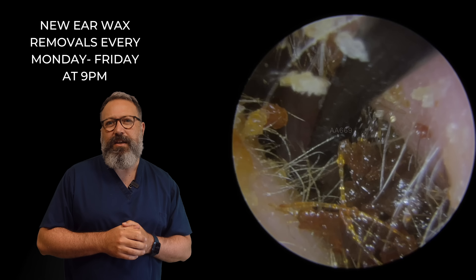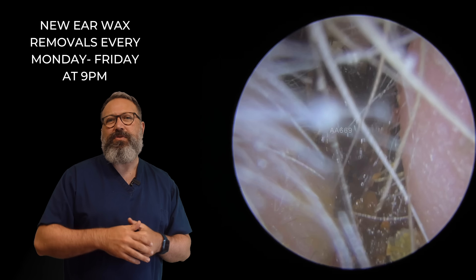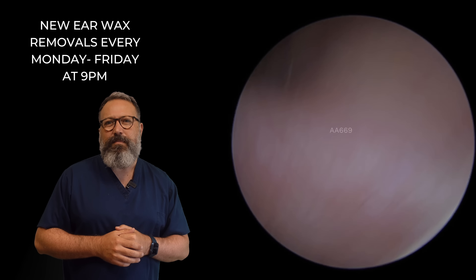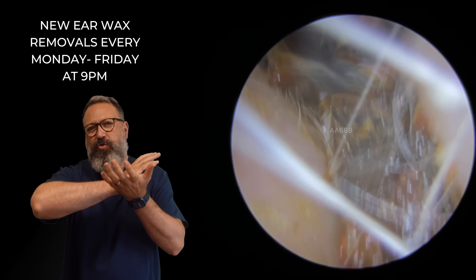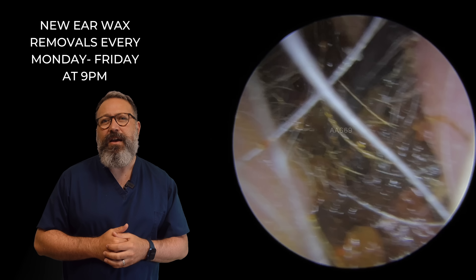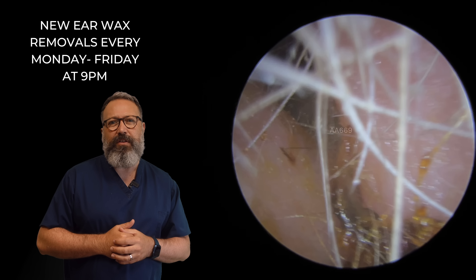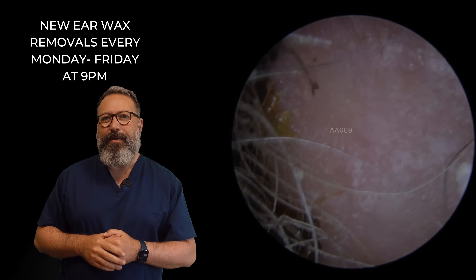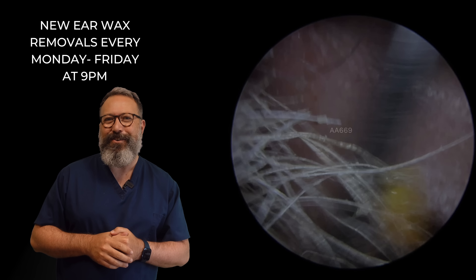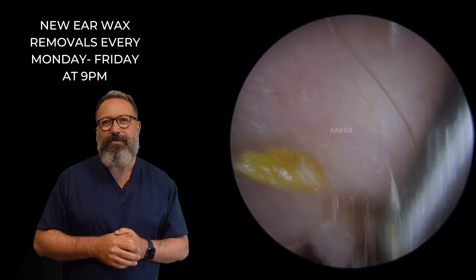Just got the Jobson horn in here now. I find that a little bit more effective sometimes when you're trying to pull the wax through these very narrow canals. But as we're moving across the top, it's crumbling the wax. You can see it just disintegrating in front of the Jobson horn there. So we've got to scoop quite low. There we go — I've pulled the whole thing through. I'm not going to attempt to pick that up. You can see it's not going to go with the Jobson horn, so we'll grab that with a little bit of suction so you can see what that looks like.